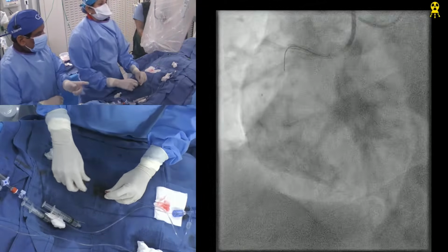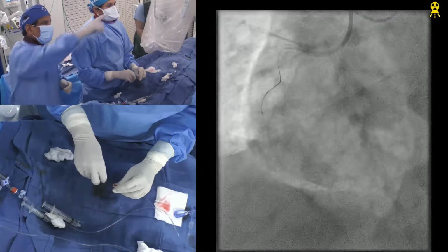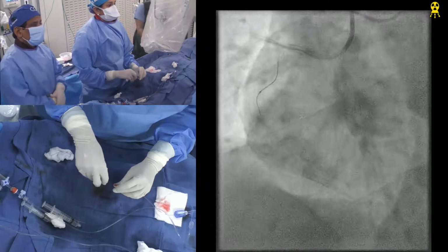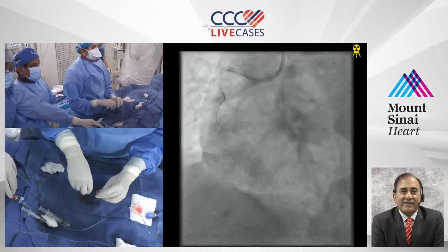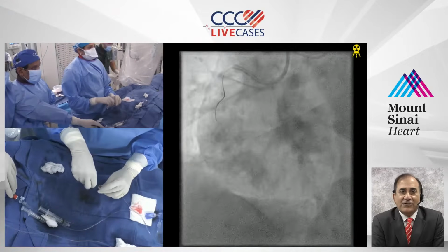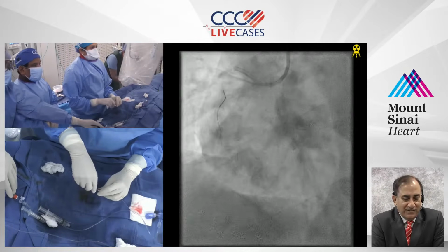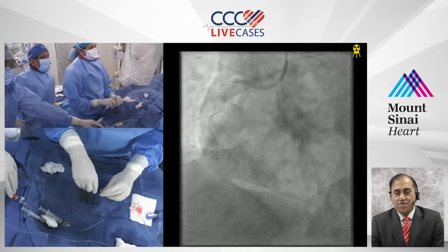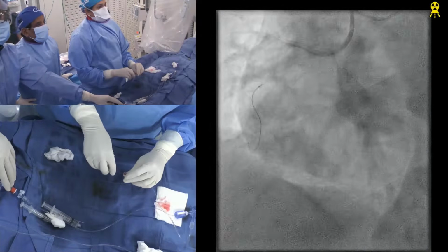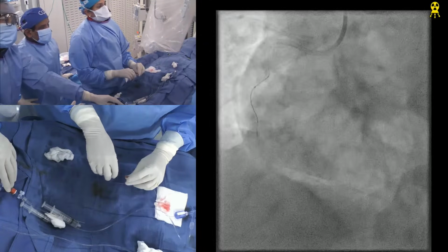You want to go caudal view a little better? That's a cranial. The other fascinating observation is that a lot of these cases are stopped here. You bring them back after 3 months, and it's created a beautiful channel. Yes, that's absolutely the part which we have demonstrated. This actually looks a little better right now. At least the direction is.